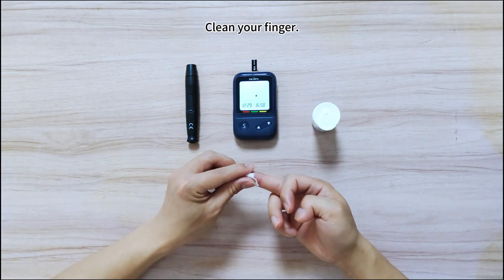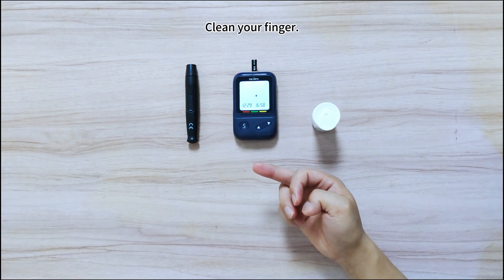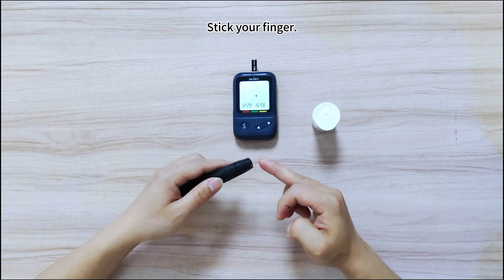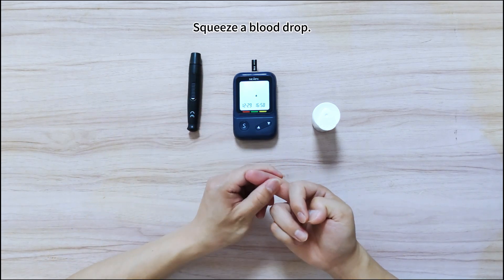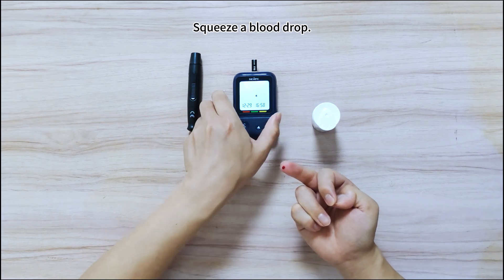Clean with alcohol wipe and wait until it dries. Hold the lancing device firmly against the side of your finger and press the release button. Gently squeeze your finger until one small drop of blood is visible.